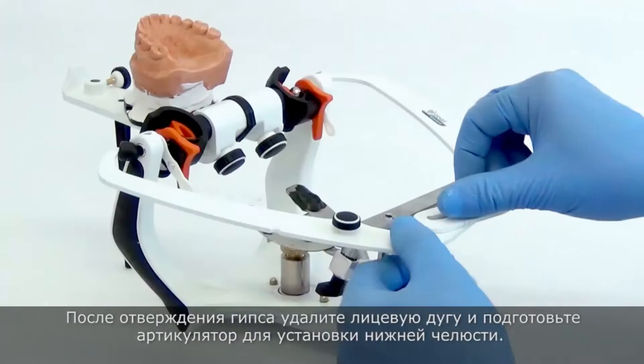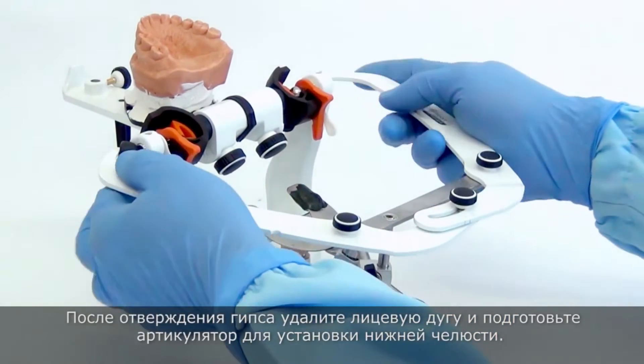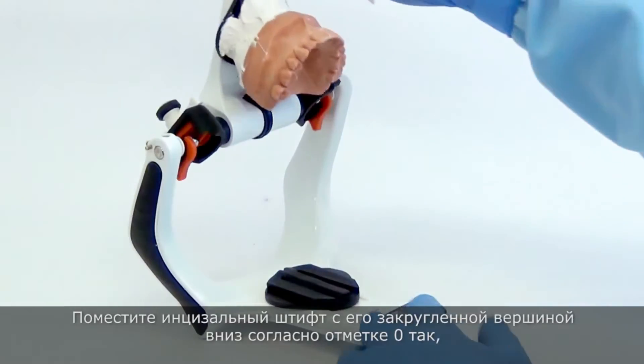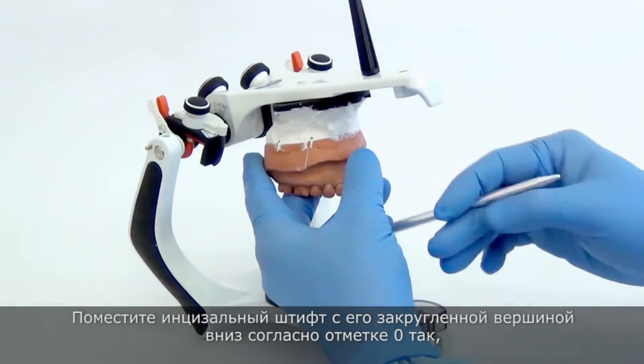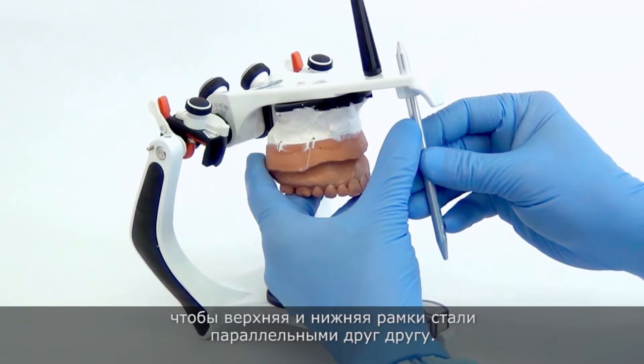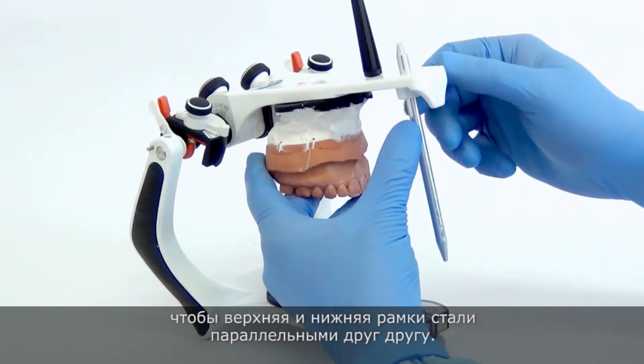After curing the plaster, remove the facebow and prepare the articulator for the lower cast mounting. Put the incisal pin in its rounded tip facing down and place it at the zero mark so that the upper and lower frames are parallel to each other.